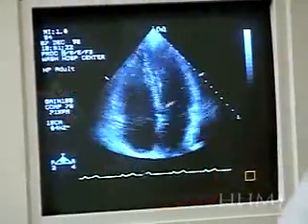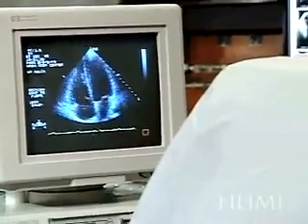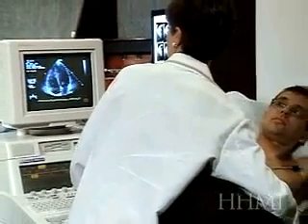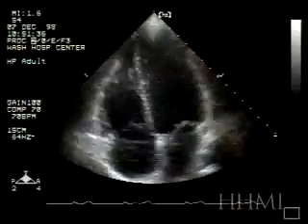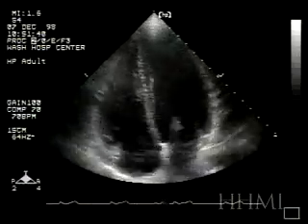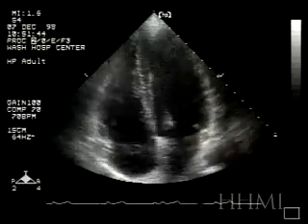Diane Fatkin is a cardiologist from Australia who's a researcher in our group in Boston, and she is now going to show you an echocardiogram of Dr. Kevin Davies, in which we will see normal heart structure and function. We are, by convention, going to begin with a view that shows the heart turned upside down, with the atria on the bottom. Here's the left atria, the right atria.